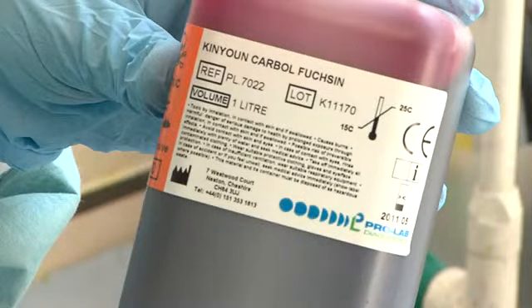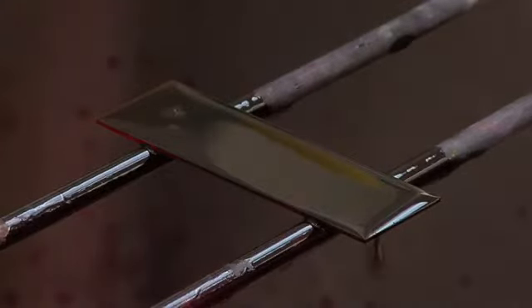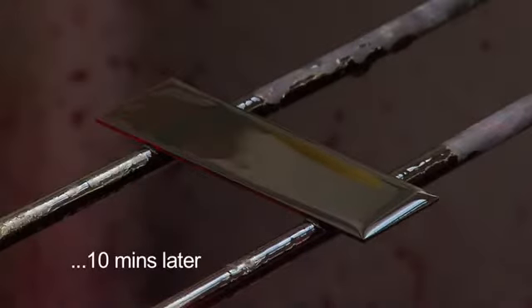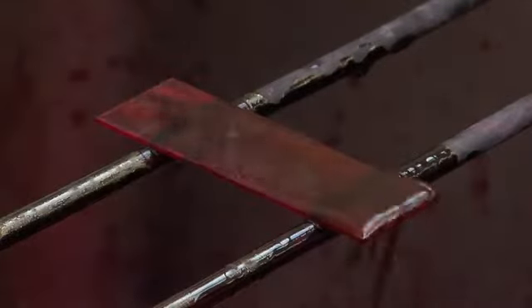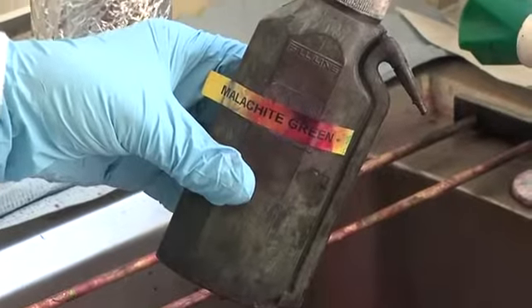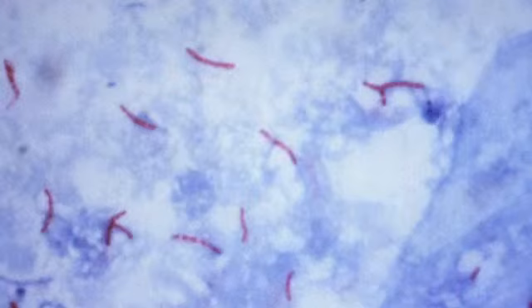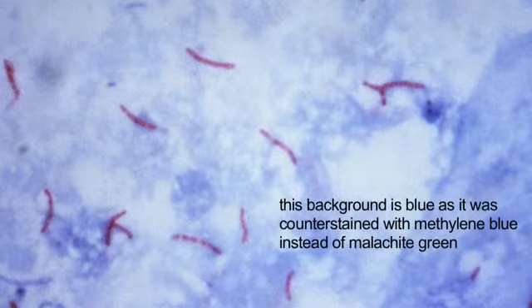An alternative stain is the Kinyoun cold ZN stain, which uses Kinyoun's carbofuchsin for 10 minutes, which has a high concentration of phenol in it, and it does not require heating as you would need to do for a regular ZN stain. After the carbofuchsin, 3% acid alcohol is added for 5 minutes, and then counterstained with malachite green for 30 seconds. Acid alcohol fast bacilli appear as red rods against a green background when viewed using oil immersion at a ×1000 magnification.